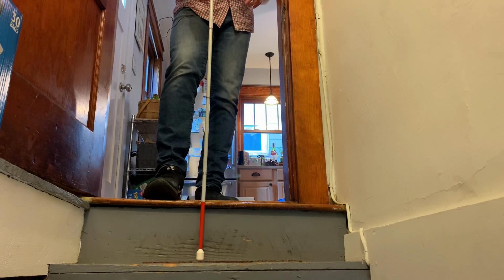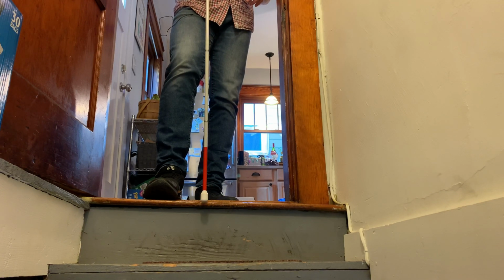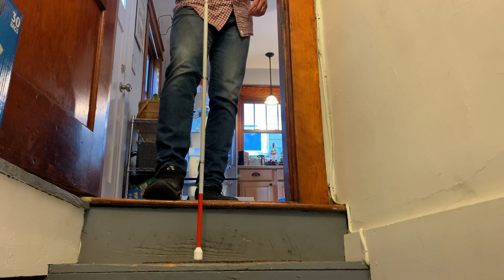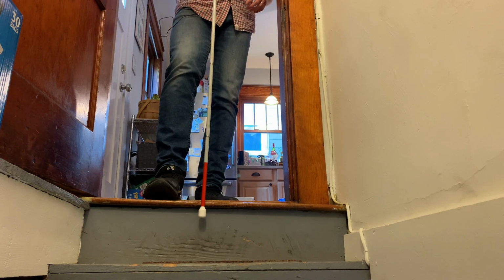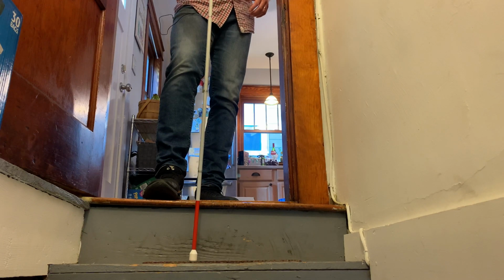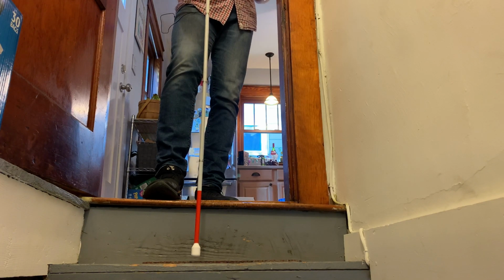So to do that, I can just raise the cane straight up until I find the landing again. So now I know how high the stair is, and then I could sweep it forward and find out how wide the stair is. So again, I could bring the cane up to the landing. Now I know how high, and then bring it out in front of me while it's resting on the stair until I find the edge of that first step, and now I know how wide the stairs are.